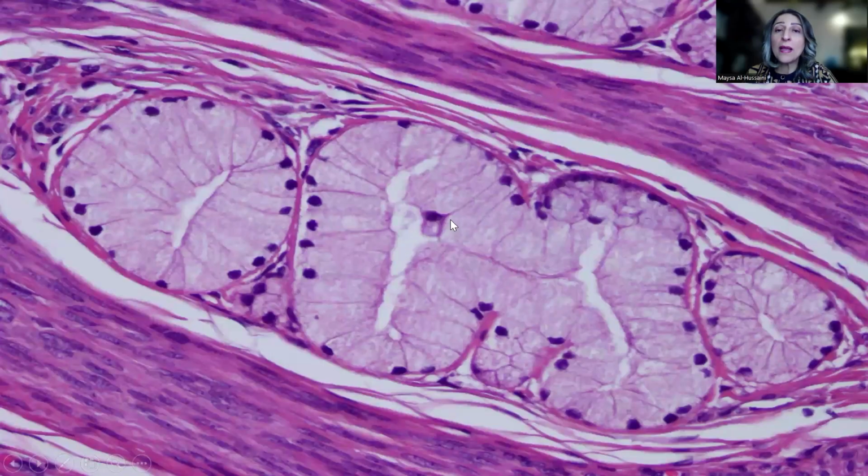And on higher power magnification, as you can see, a large amount of cytoplasm and well-defined cytoplasmic borders clearly separating one cell from the other. This is very characteristic actually of this type of tumor. Again, you can see here the very well-marked cytoplasmic membrane, and then we have the sometimes clear, sometimes pale acidophilic cytoplasm, as in this case.